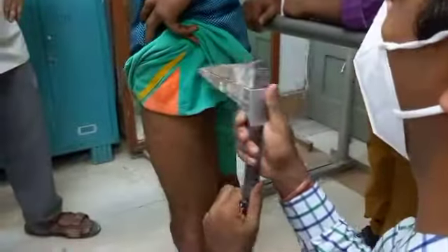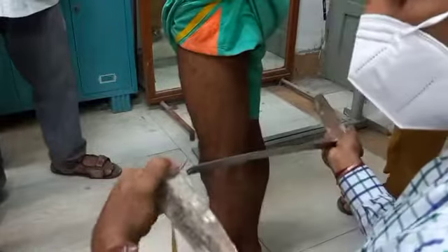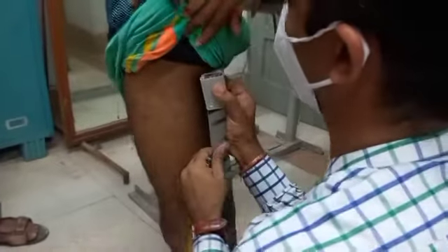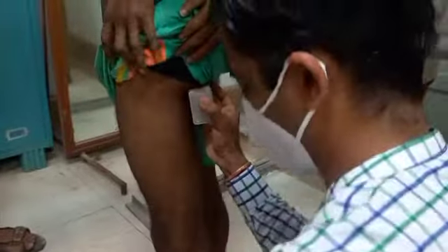Doing it properly means the top surface needs to be horizontal, right? The top surface must be made horizontal, and then I will place it beneath the IT, and I will mark that level on the lateral side. Okay, mark it there.